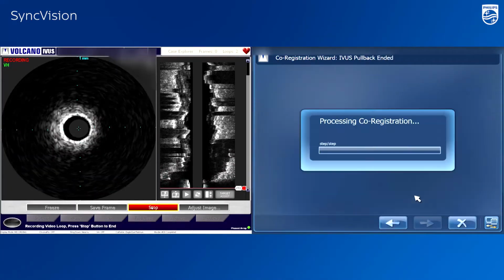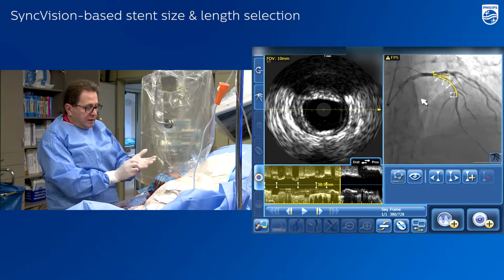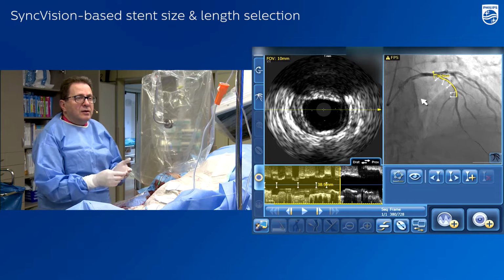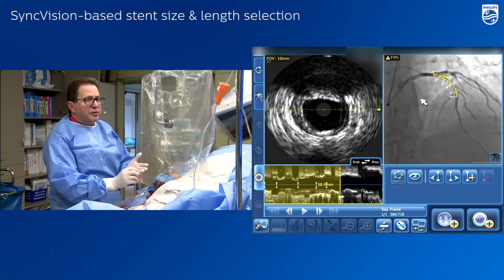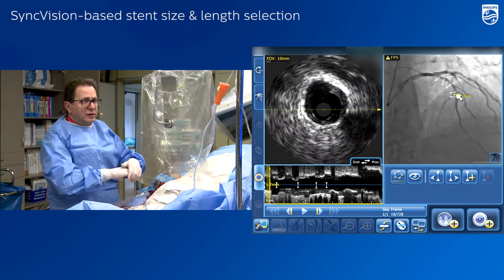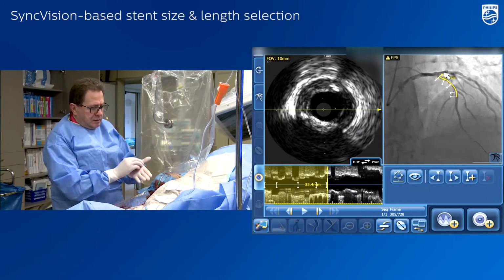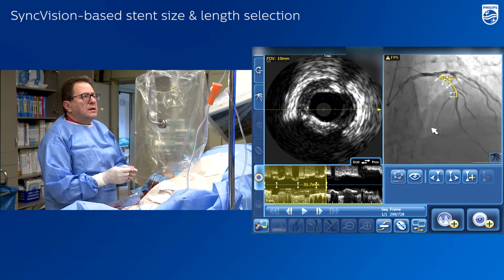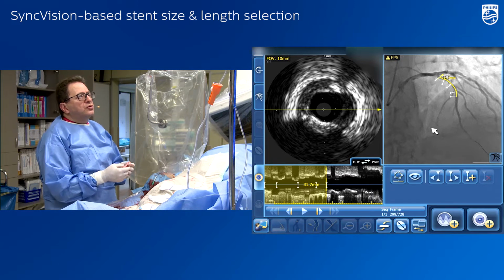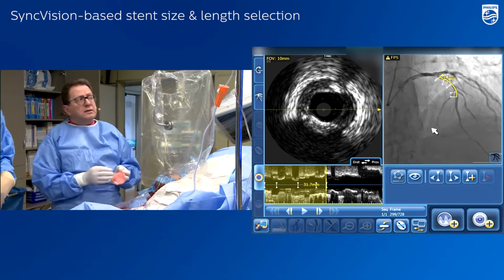Okay, stop. Trying to cover the whole stenosed place, it's close to 40 millimeters. So personally, I don't like this approach, because we really didn't establish the so-called healthy zone for the proximal part. What I would like to say is that we should try to park with the first stent just before or just after the first diagonal.